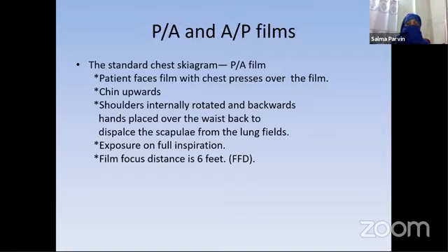So the important point is, whenever you have a film exposed in AP position, the patients are really much ill and acutely concerning, such that the patient cannot stand up or does not even have the ability to be seated.